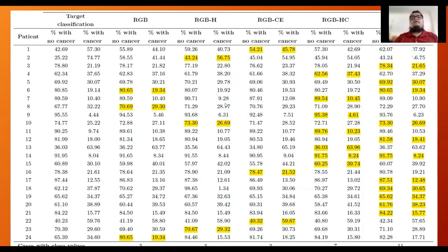In all of them, we obtained good results, but the best methodology was the one with data augmentation. In the last row, you can observe the cases with values close to the real one. And we can observe that combining the histogram stretching and the unsharp masking methods without data augmentation also obtains good results.